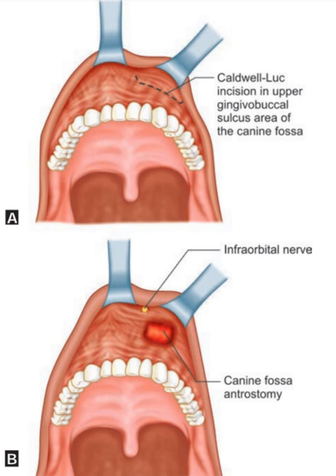Incision. Lip retractor retracts the upper lip. Cheek retractor can also be used for making a horizontal incision with its ends upward in the gingivolabial sulcus below the canine fossa. The incision cuts through mucous membrane and periosteum. In children, this incision is made above the level of secondary dentition, which can be seen in plain radiograph.